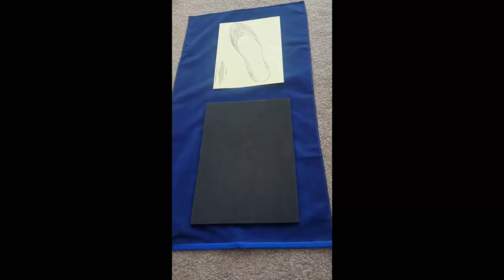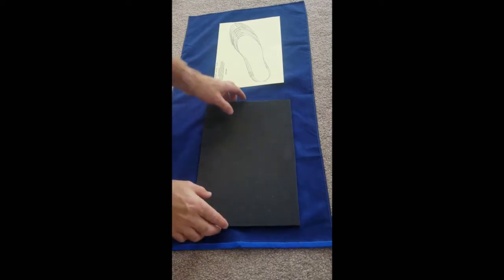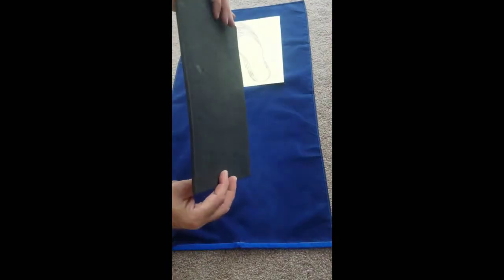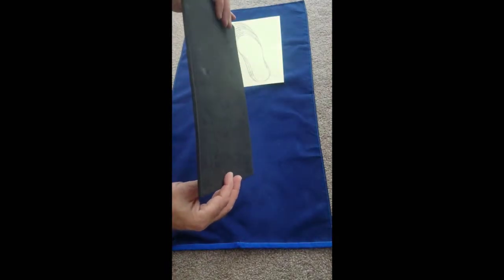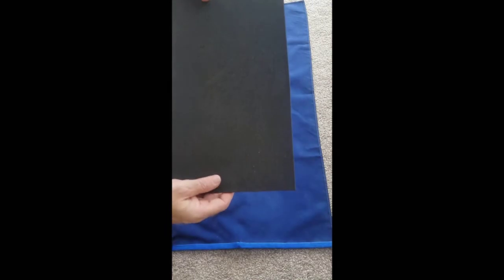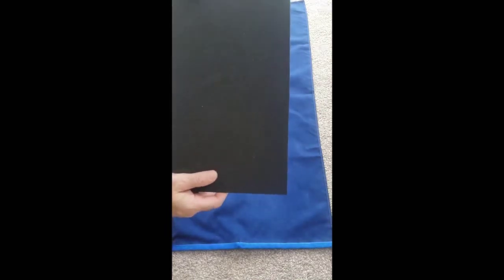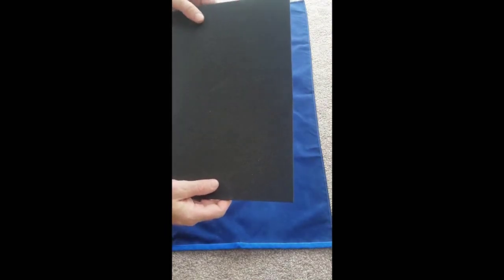Welcome to First Aid for Feet instructional video on our Plastazote sheet. This is a Plastazote sheet. It comes as a rectangular piece about five millimeters thick and it's designed that you cut it as insoles for inside your shoes.